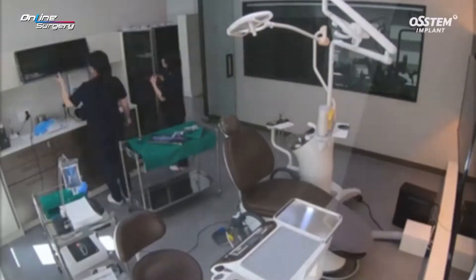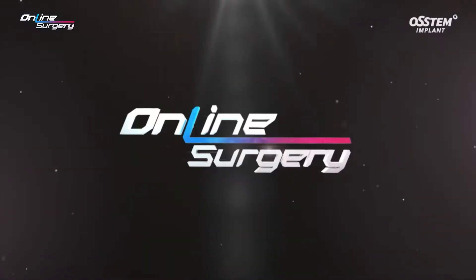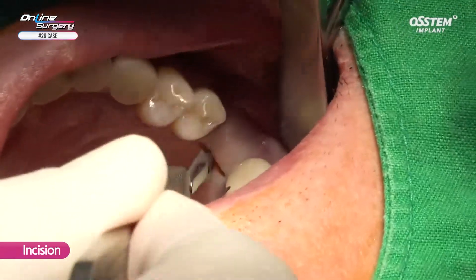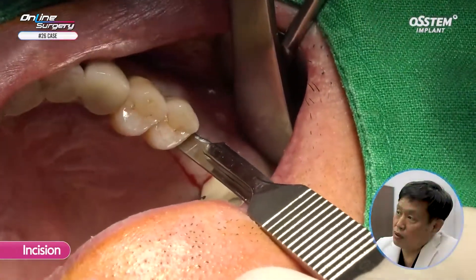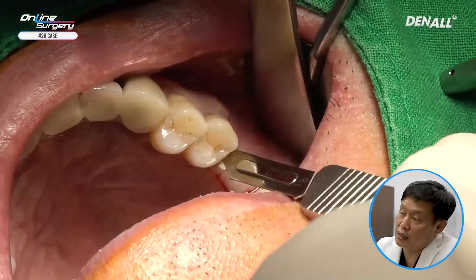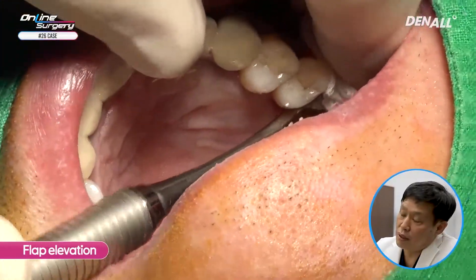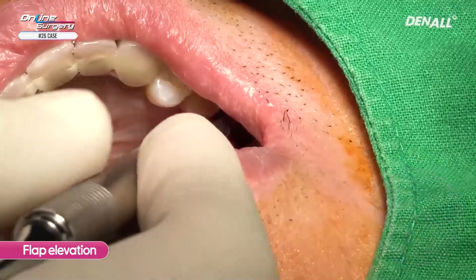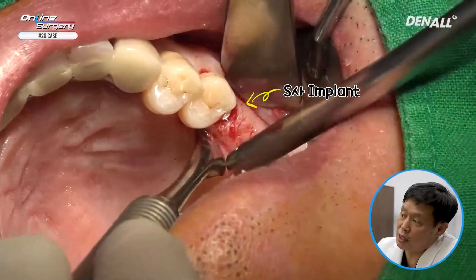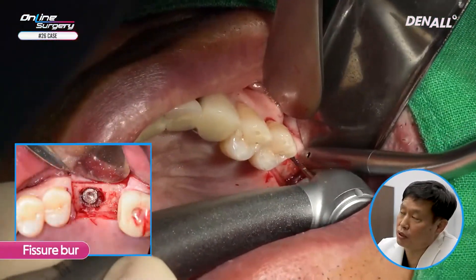Let's look at the surgical clip. It has been a week since the implant was fractured, and more so than expected, gingival healing was achieved. I am going to make a pericrestal incision and reflect the flap to check the implant position. Once I have elevated the flap, you can see the superior component of the implant, which was fractured.